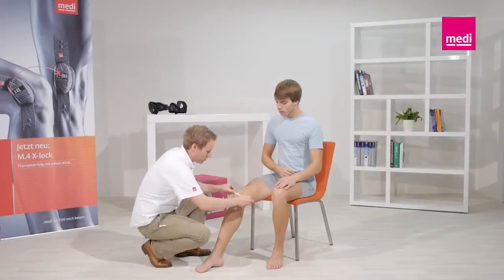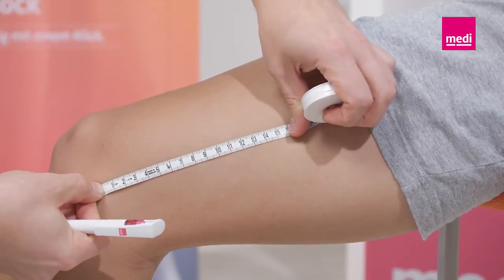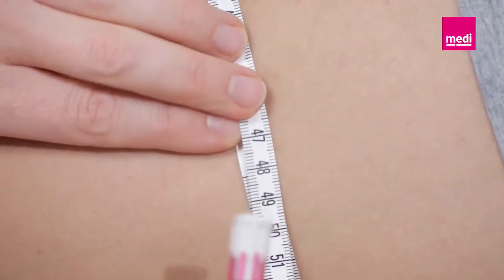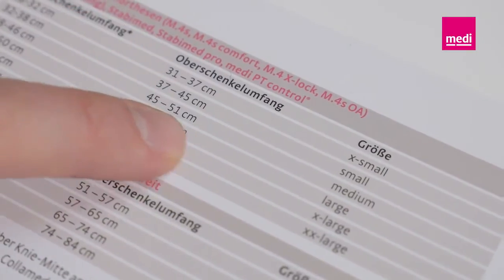To determine the correct size of the orthosis, please measure the circumference of the affected leg 15 cm above the middle of the knee joint on the medial side. You can then select the suitable product from the size chart.